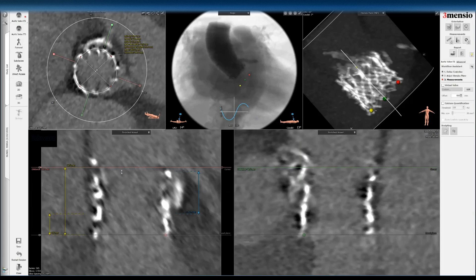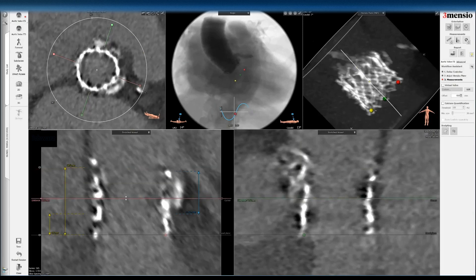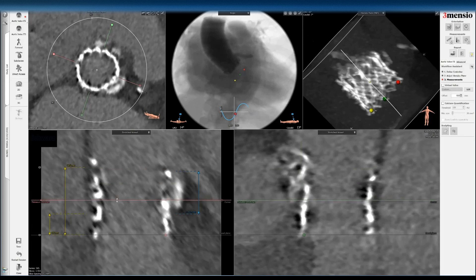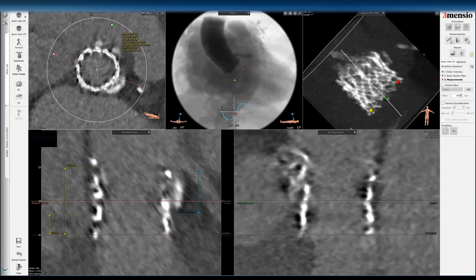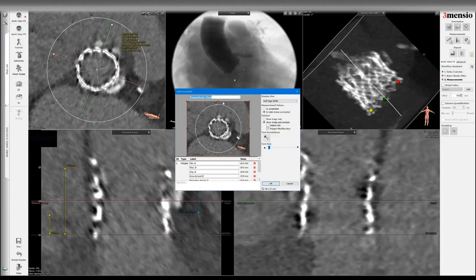I also look at the midframe because sometimes there's a waist in the middle. Even a balloon expandable valve might not be truly circular. Taking the frame height of 19.5 and going to the midpoint at about 9.7, I measure the midframe. It's also useful to look at commissure orientation here. This is 20 millimeters — the mid part of the frame is grossly underexpanded compared to a nominal 23mm SAPIEN 3. Could that be why the valve failed? That's certainly a possibility.